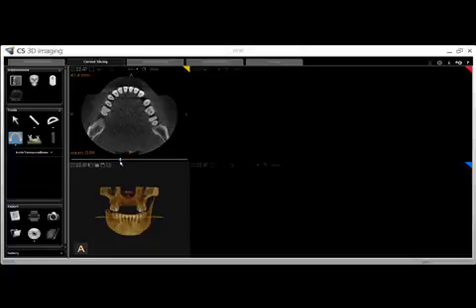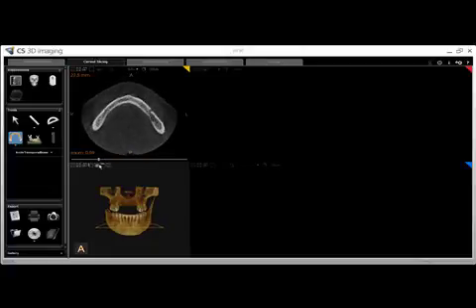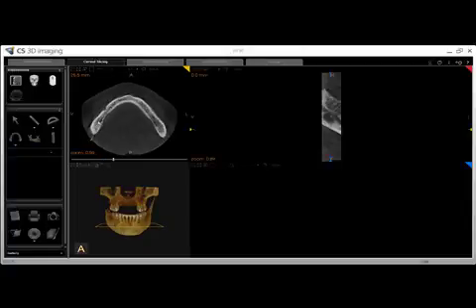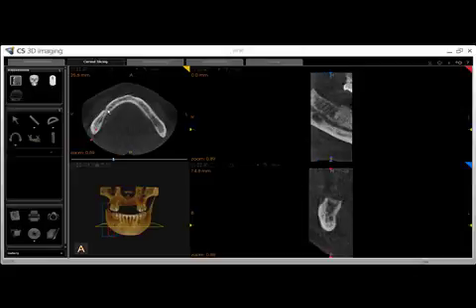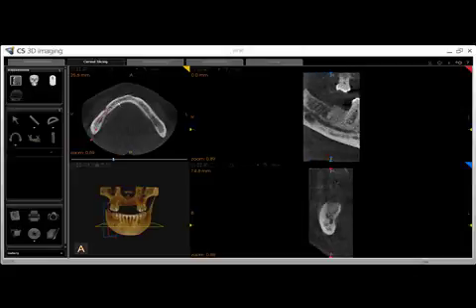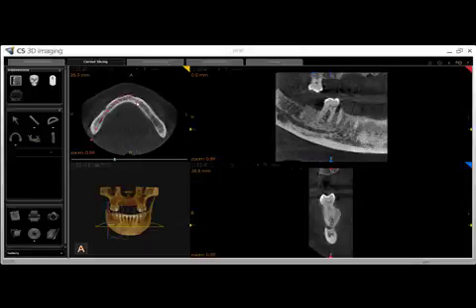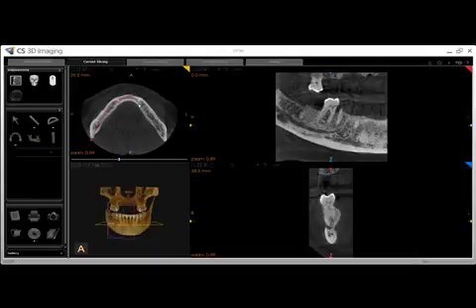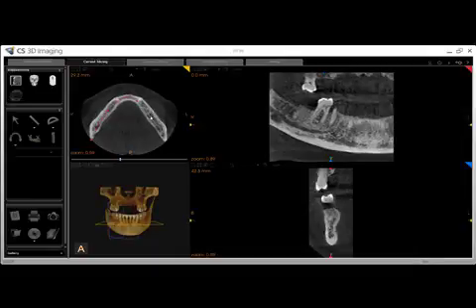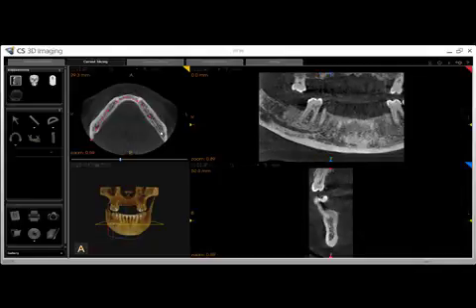Use the slider bar beneath the axial view to move the slicing up or down. Once you've selected the Arch Curve tool, use a series of left clicks to move around the arch. In this example, we are drawing a mandibular curve, so try to click along the mandibular nerve canal. You may use the scroll wheel on your mouse to move inferiorly or superiorly to visualize the canal. Double-click when finished.